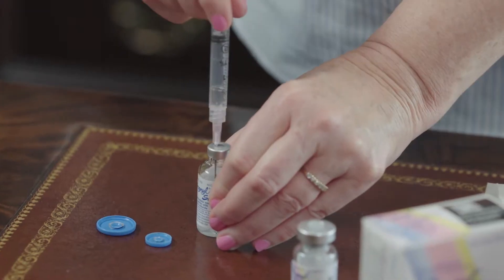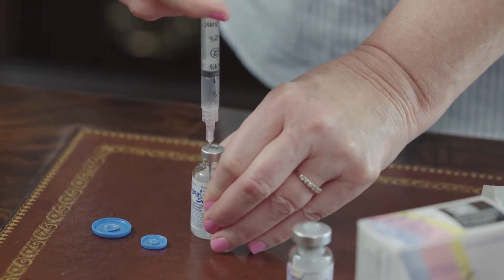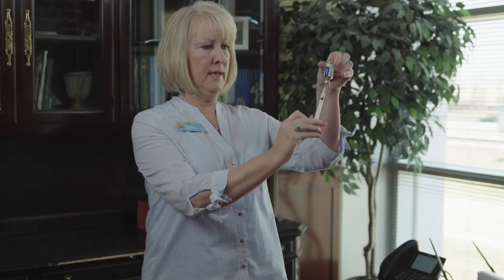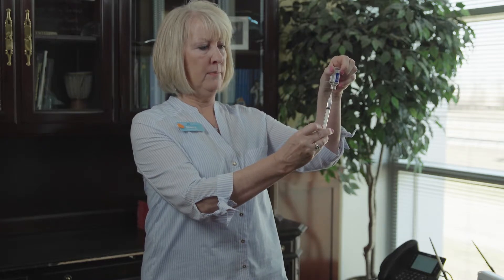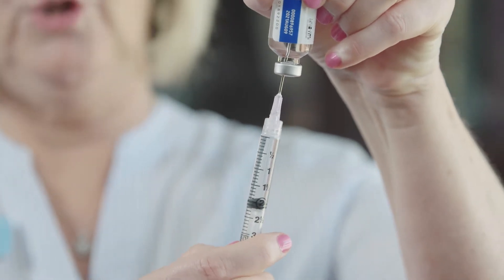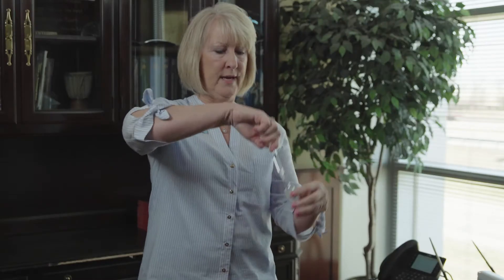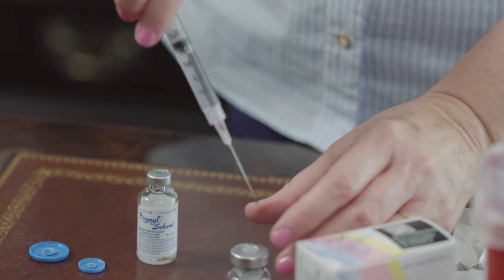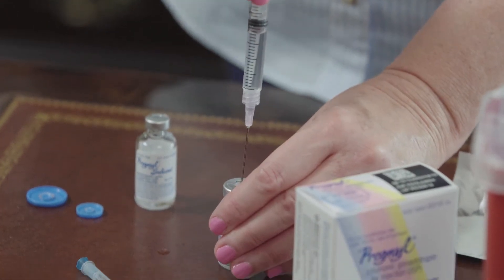Pull the cap off the mixing needle. You are going to want to draw two mils of air into your syringe and inject that into the vial that has the liquid. Turn the vial over with the syringe pointing toward the ceiling, making sure the tip of the needle is in the liquid, and pull down on the plunger until you get the top of the black stopper to the two. Turn the vial over and pull your syringe and needle out, and inject the two mils of liquid into the vial of powder.